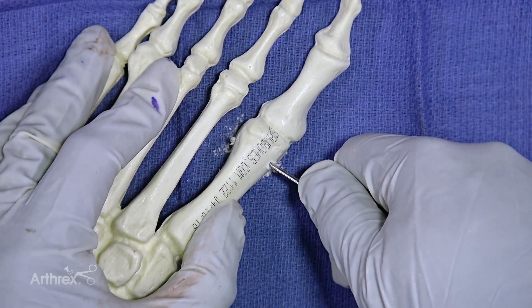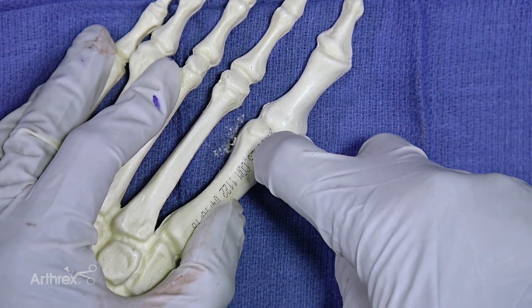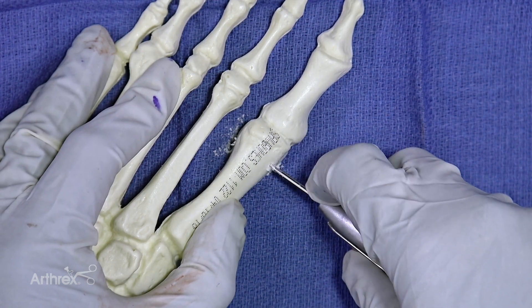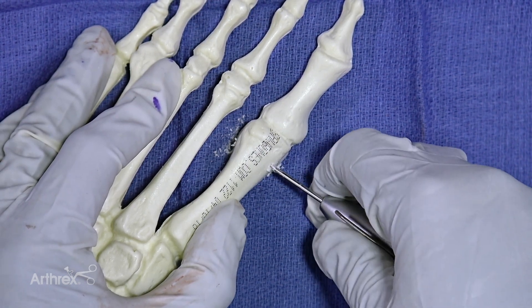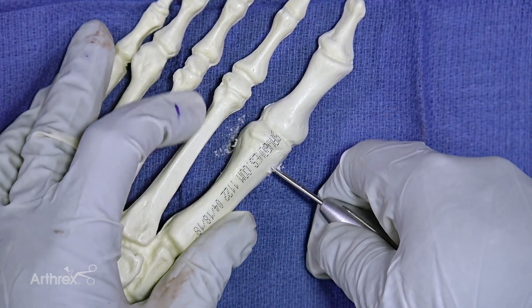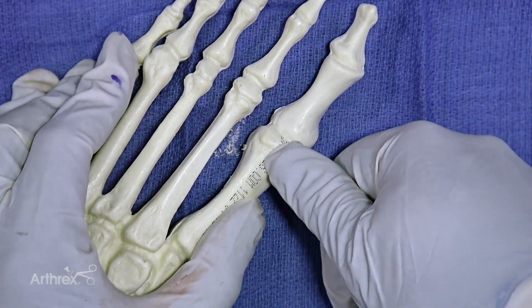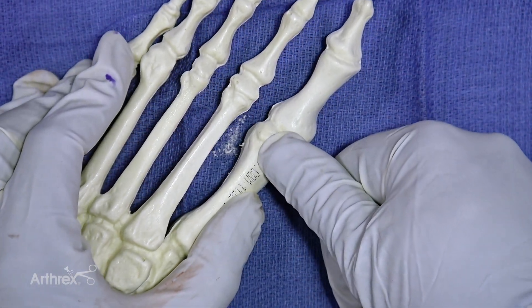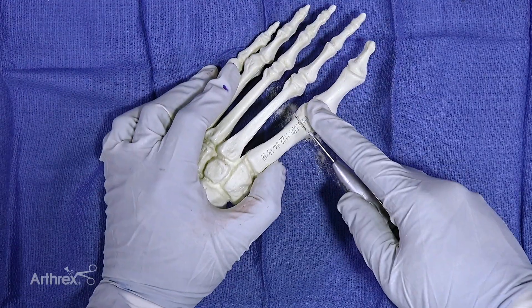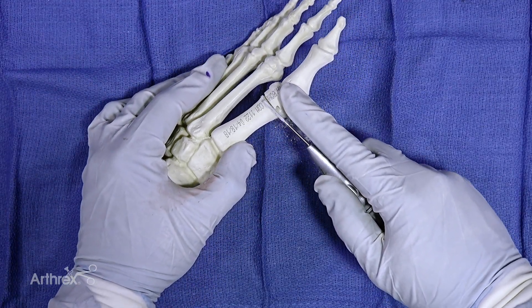The next maneuver is going to be straight up and down. We're going to use our incision as the fulcrum — we're not going to directly translate the burr up. We're going to rotate our hand down, and in doing so we're going to bring up the distal part of the burr and affect the cut in the distal portion of the metatarsal. So we're going to rotate our hand like this and perform our cut like that.